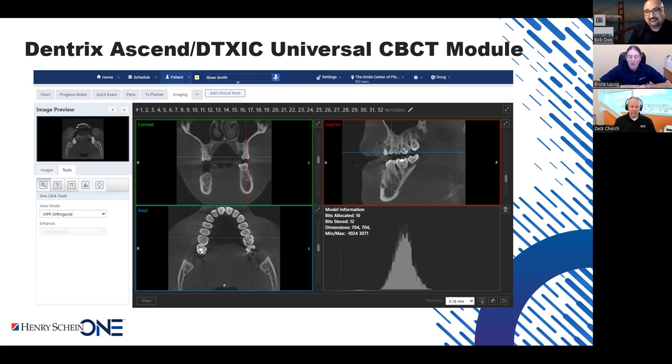Perfectly put, Dr. Bob. One of our earlier slides talked about how the hardware has grown up. When cone beam scanners were still $140,000 and $160,000, it took a major investment, and our general practitioners that weren't placing implants didn't need to spend $140,000 to do three-dimensional imaging, even though there were large benefits to it. But now a cone beam scanner can be $60,000 or $80,000 or less, and it becomes similar to the price of a very high-end pan.